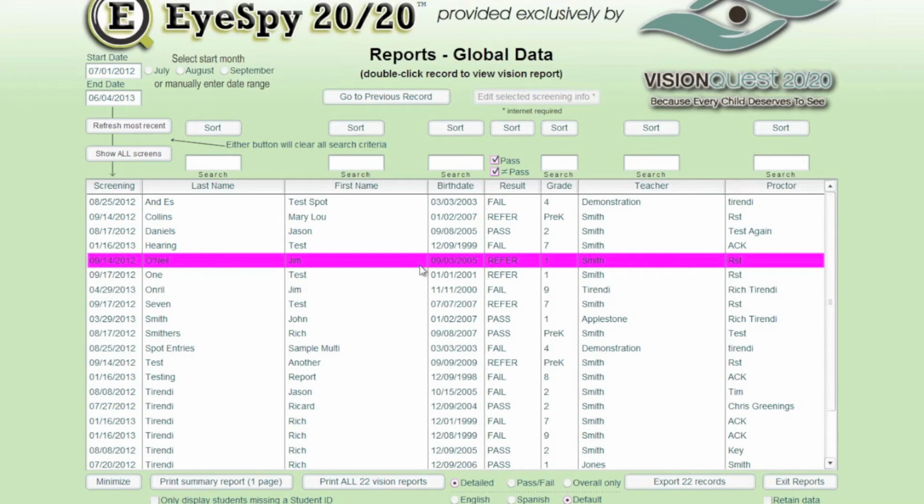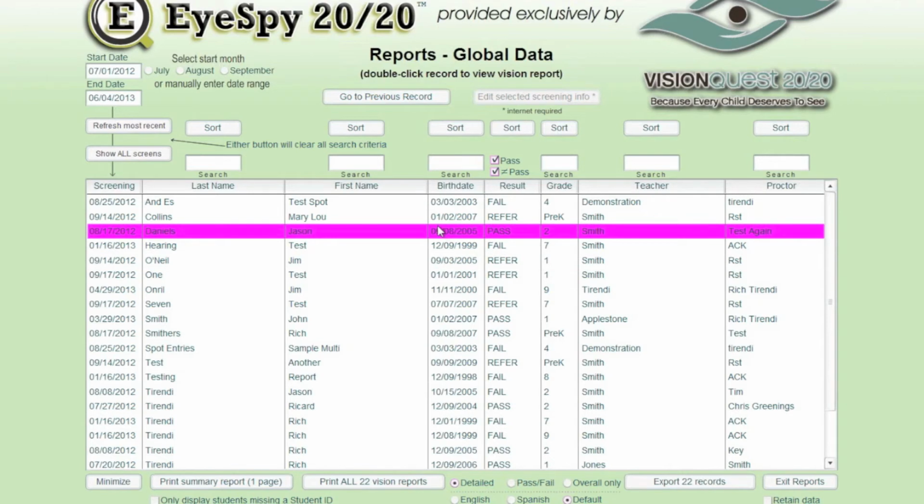It's just a question of time and resources. So we've architected the system for all of these future capabilities, but we're biting off one piece at a time, so to speak.